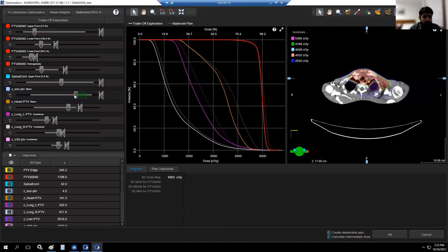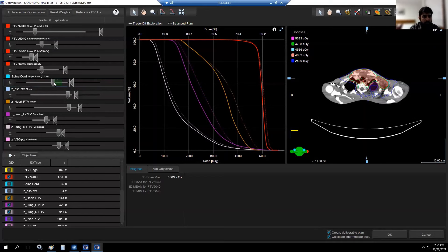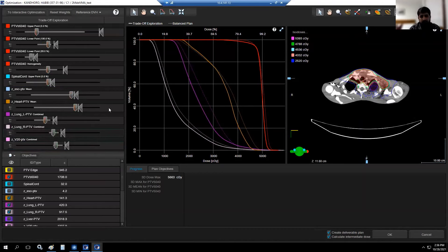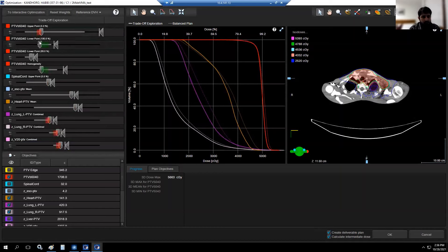Now I'm moving the esophagus slider — although it's not of major concern here. Moving esophagus doesn't move other objectives, so there's no harm in further reducing the esophagus dose. Similarly for the spinal cord — you can move it and nothing else is moving, so you can reduce it further. If you are not happy, you can reset the weights to go back to original settings, then click OK to calculate the deliverable VMAT plan, which will take some time.